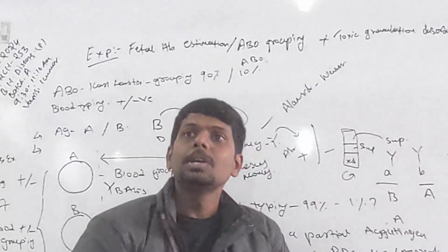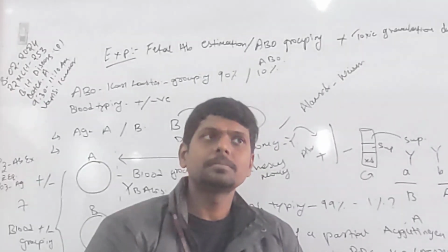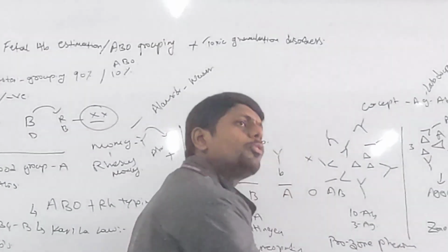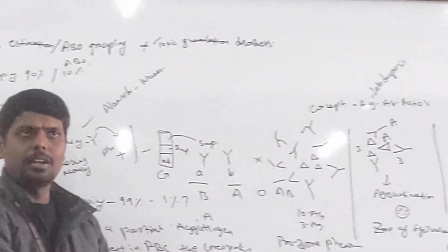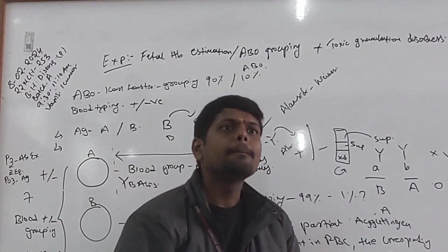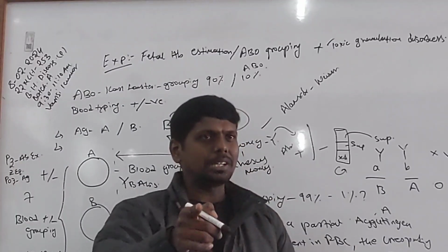Improper handling. Improper handling, inadequate mixing, that is good. Any more? Quantity, very good. That we already discussed. Quantity of blood and serum. Anything that leads to false negative. Any more? You want to add? Wrong reagent will get erroneous results.